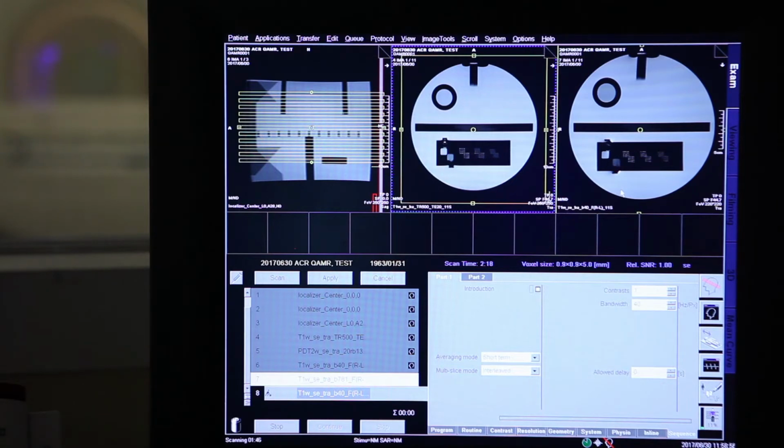You're right. Okay. So with these tools, or with this technique, you are able to measure actually if the bandwidth is okay or not. So this is a good question. The bandwidth that the system says it delivers is the real one. So you can check it with this ingenious design. You have fat and water, so the water fat shift is there. You are able to measure the fat shift. It's really very important. Okay, now we'll wait for 1 minute in order to see these two structures at the specific position with the lowest possible fat shift due to the high bandwidth. That's the point.